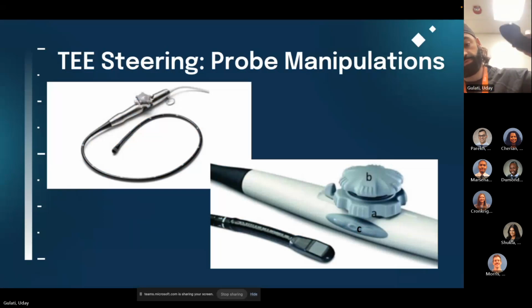Okay. So this is where I keep the wheels here. And then when you're holding the probe, you hold it like this, so that way your thumb can easily press these buttons. You see what I'm doing? So that C is right here, I can just press like this, and then I can also rotate the wheel. I have my middle finger and my thumb grabbing the A wheel, and then I can just move my thumb up to press those buttons if I keep it upside down like that. Cool.